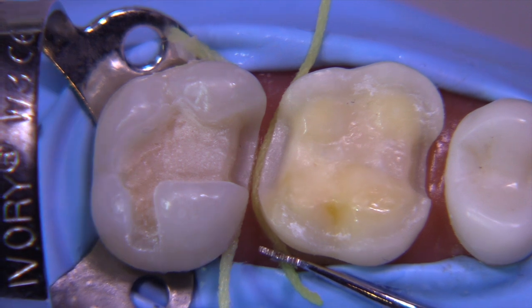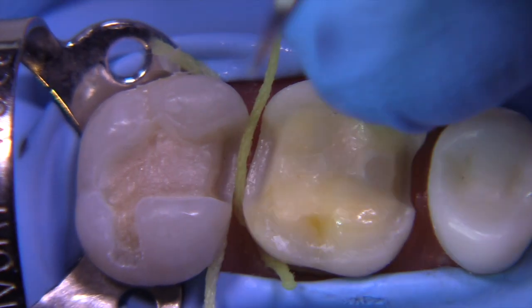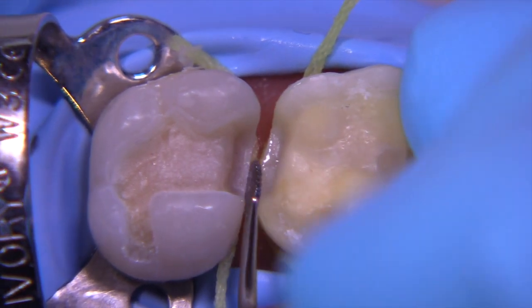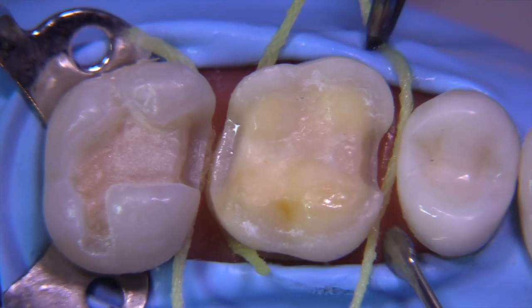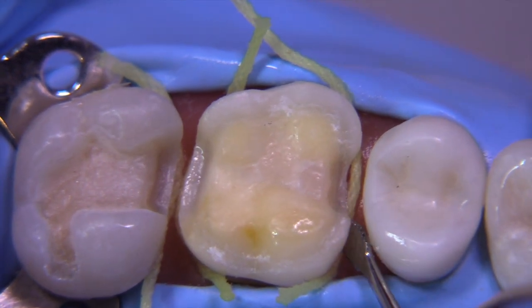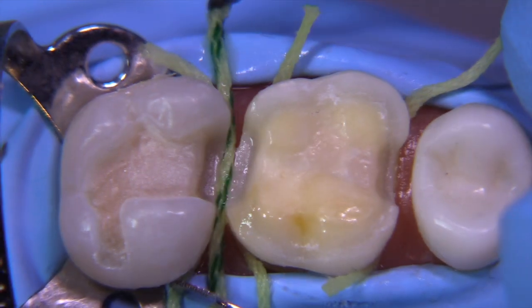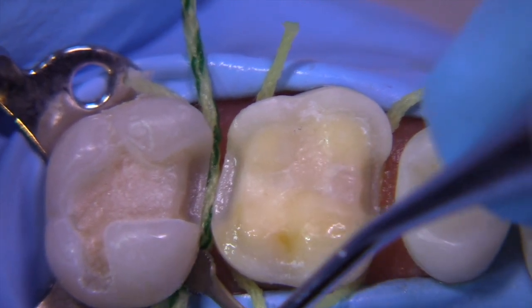Would a laser be effective here? Sure. Could you use electrosurgery? Absolutely. My personal favorite when I have the space is cord. When we have redundant tissue, I think electrosurgery or lasers are very effective, and I use both of those modalities in my private practice when indicated. Now we're going to go back and make sure the previously placed cord is pushed down into the sulcus, then place the final cord. We're doing this with the rubber dam in place because the patient has not yet gained control of the procedure — you're still in charge, the area is isolated, the patient won't be talking or rubbing their tongue, and you'll maintain really good moisture control. Also, the patient won't taste the medicaments — aluminum chloride is a very bitter-tasting solution.